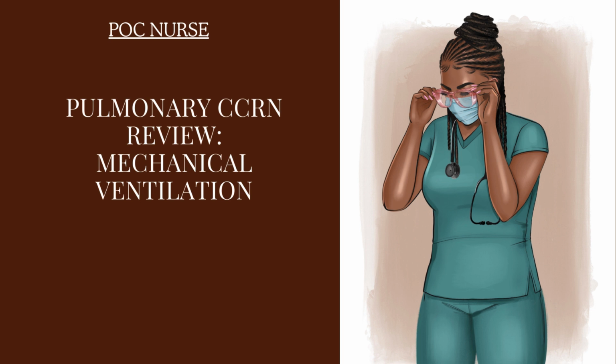If they start to desaturate, their O2 sat is less than 88%, you stop the breathing trial. If they get into any kind of respiratory distress, they're breathing fast, they're having retractions, nasal flaring, we stop the breathing trial. If they go from following commands to not following commands, confused, agitated, there's a change in their mental status, we stop the breathing trial.